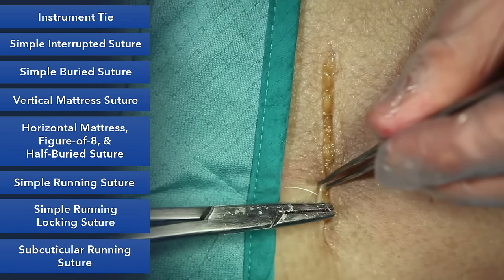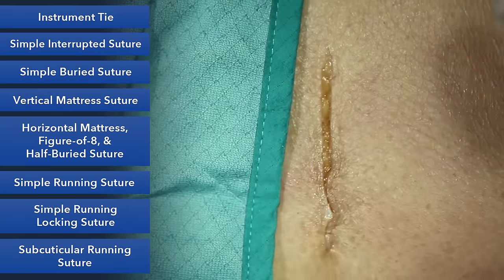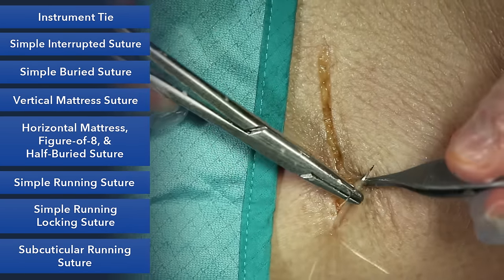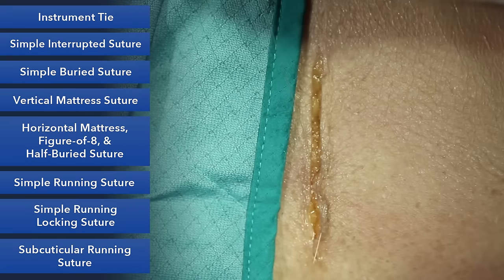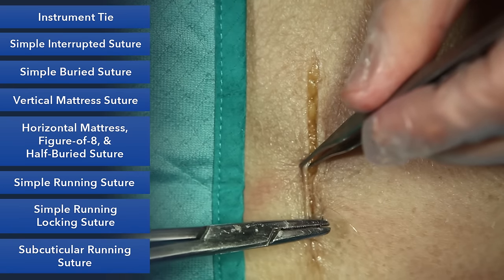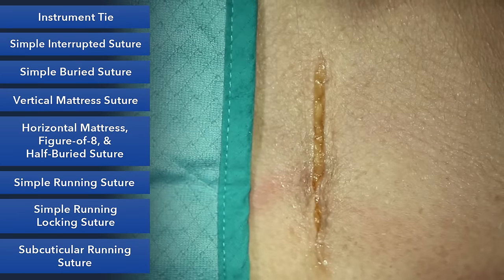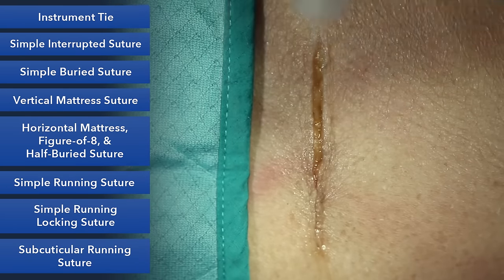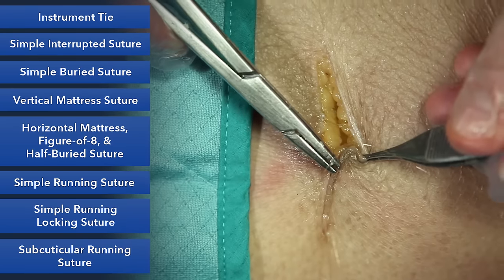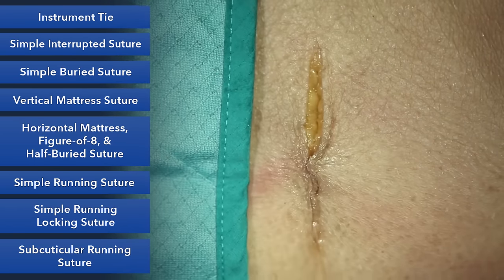Now we're going to start to take regular bites on each side. I'm trying to take the same depth and the same amount of tissue each time as we begin to advance. Keep pulling everything up and keeping tension. Notice I'm not pulling up very tight either. We're just getting the skin to approximate. No buttonholing of the skin. This is just pure horizontal dermis.